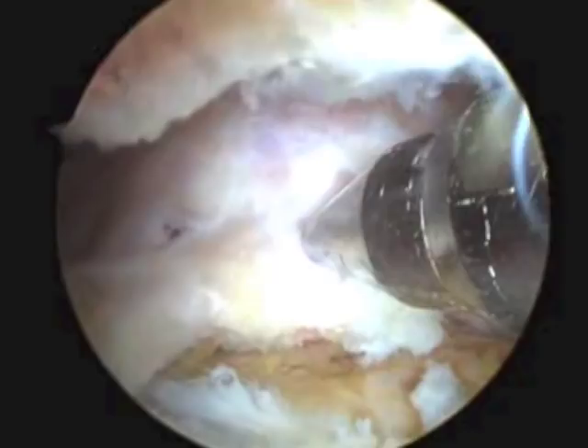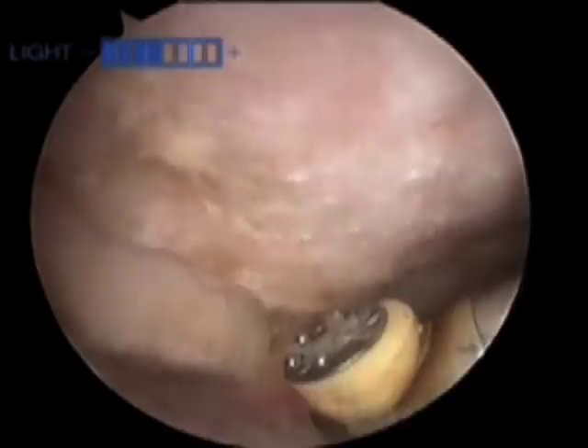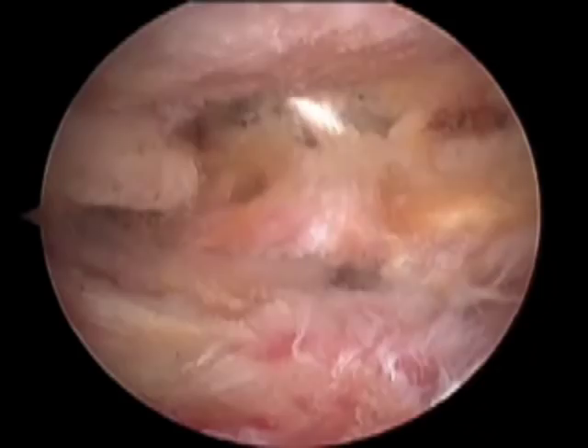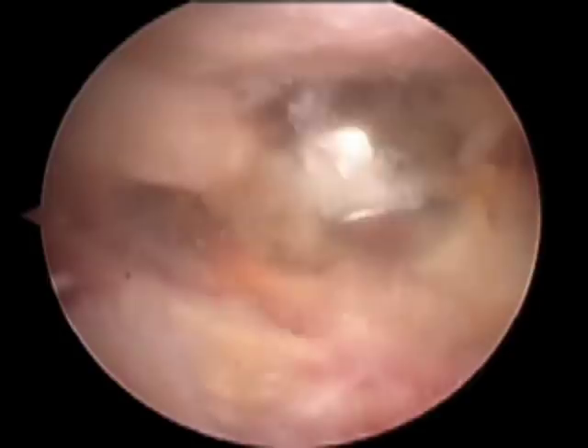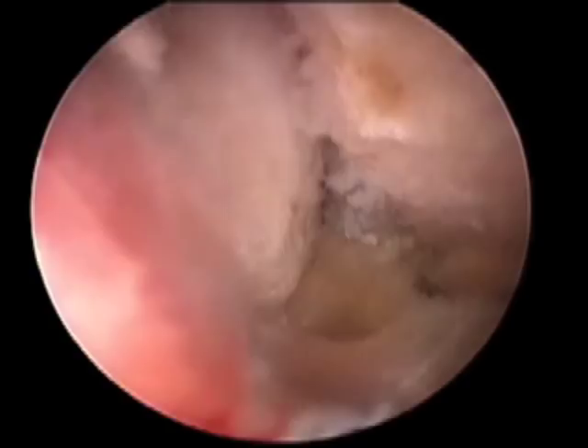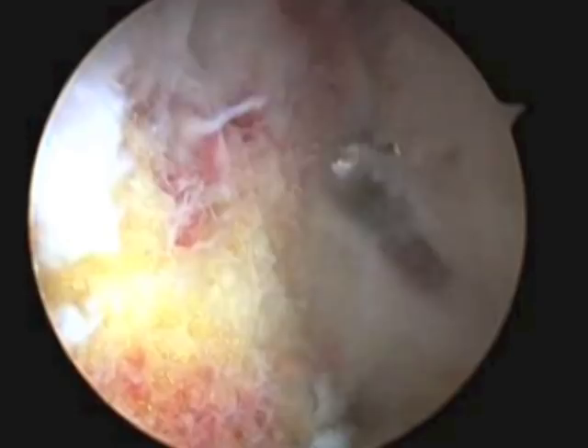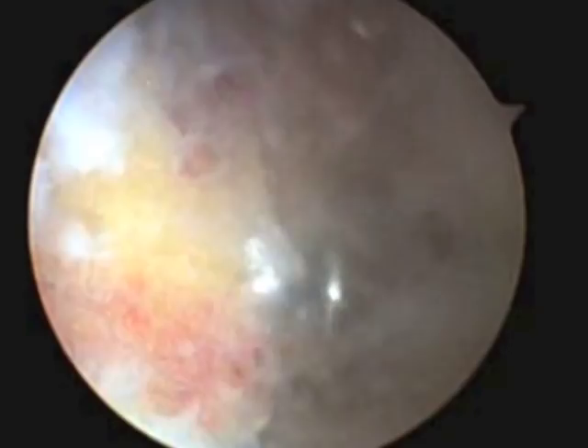So in order to cure this problem, we need to remove a small section of the end of the collarbone or clavicle so that the acromion and the collarbone don't rub on each other. Here is a different patient — you can see the end of the collarbone being moved up and down. From the front of the shoulder, I bring in a burr or shaver that removes bone, and here you can see it removing bone from the end of the collarbone. We aim to leave a gap of about a centimetre between the two bones so they don't rub on each other.